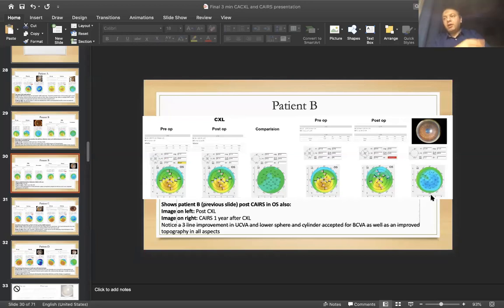Okay. I'm asking this question because all the time I was thinking about the intracorneal ring segments as a tough, hard material put inside the cornea under some pressure along the circumference of the cornea. So when it's implanted inside the cornea, it will give some flattening of the whole cornea, not just this part of the cornea. And this is the second question.